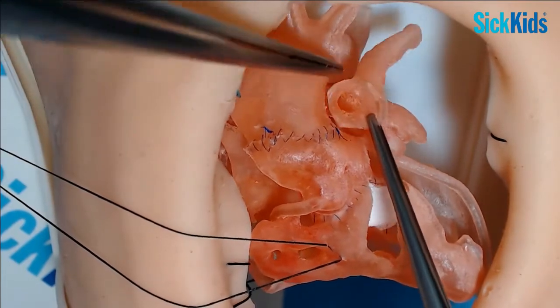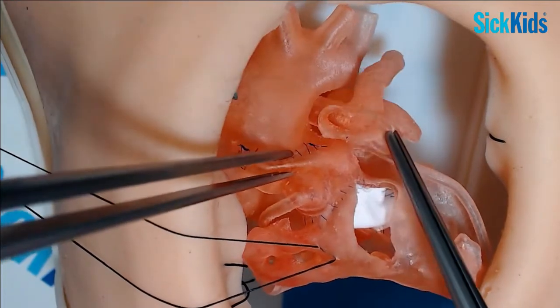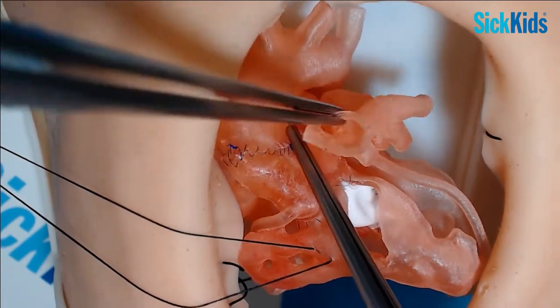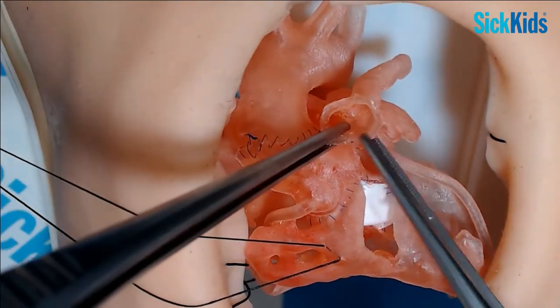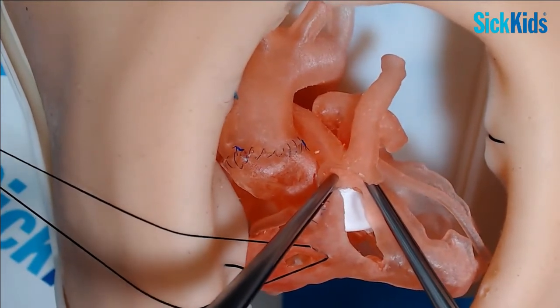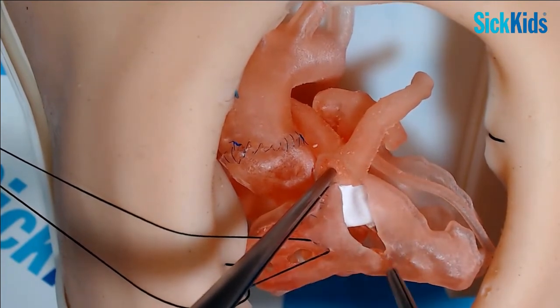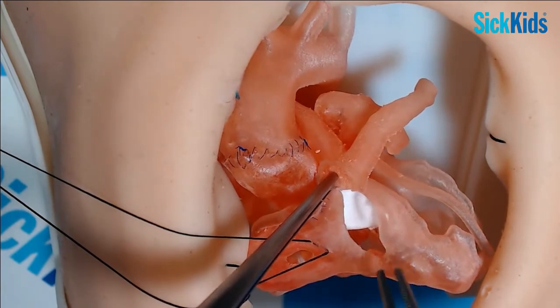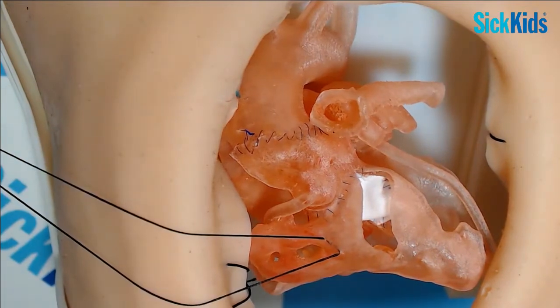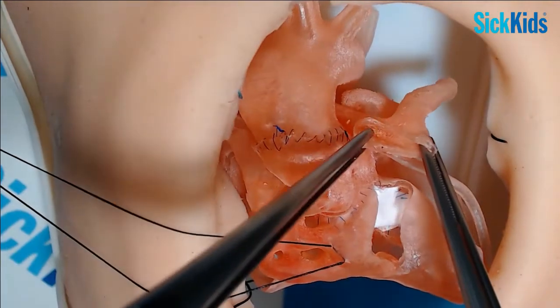You can see the pulmonary arteries on the TV screen. And often they arise much more from the leftward side like that. And if they're good sized pulmonary arteries, you can really mobilise them. You can sometimes bring them onto the ventriculotomy like this and sew them directly onto the ventriculotomy, and then all you have to do is put a patch, like a transannular patch, and you've got continuity without having to use a conduit. And that can be quite useful if you're struggling to find a small conduit.